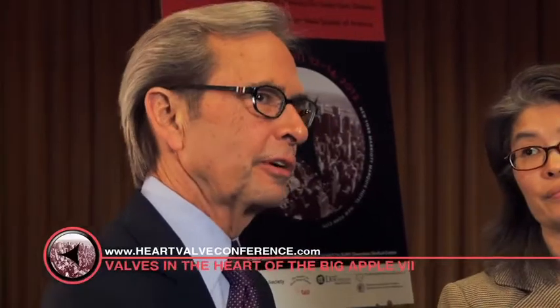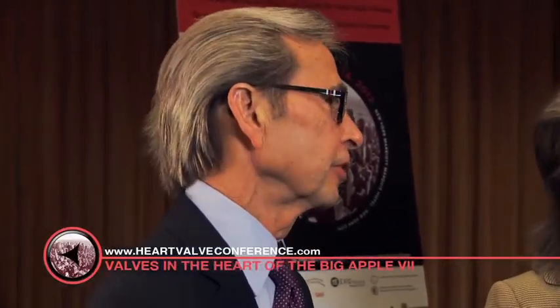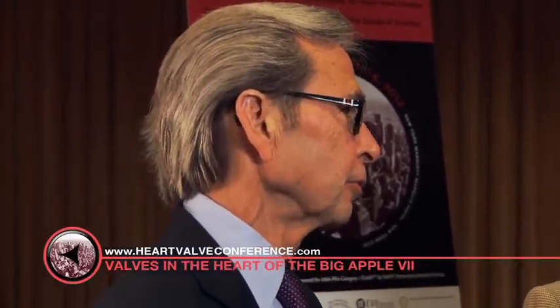Sunil, let's switch gears for a second. Absolutely. Because in the cath lab, certainly with mitral interventions, 3D is really critical. It's really exciting because for the first time now, the interventionalists really need us to provide them images. In fact, they're learning to do 3D echo just as well as we do. Whether it's balloon valvuloplasty and looking at the commissural opening, or the MitraClip, basically reducing the amount of time these procedures take.